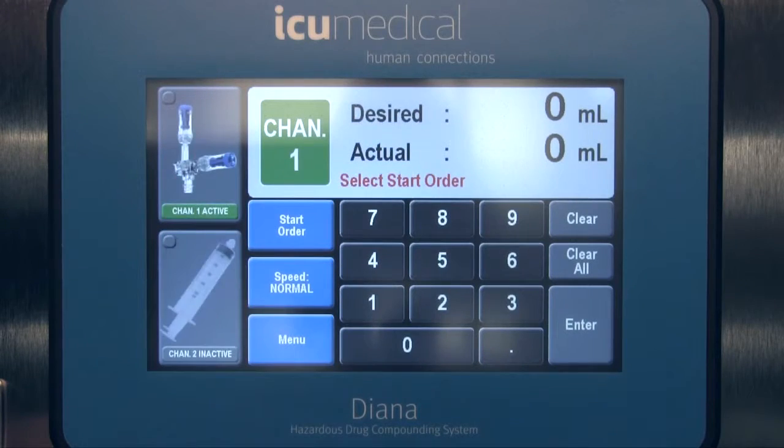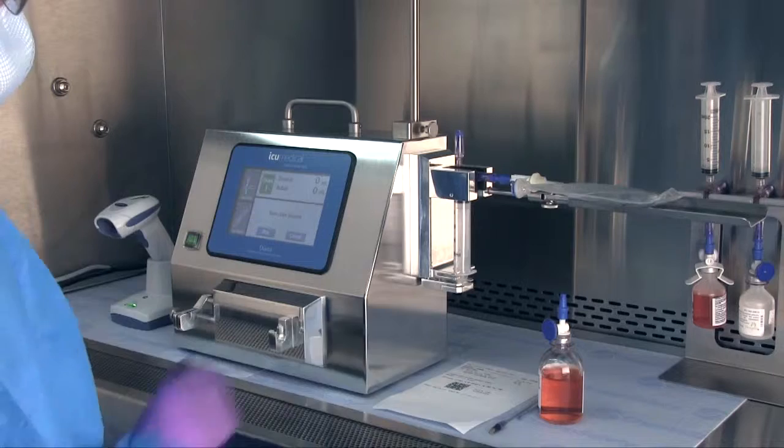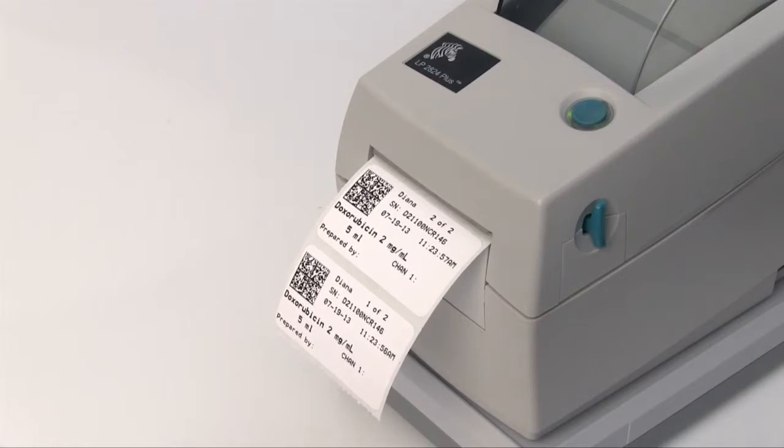Next, select the Channel 1 icon in the upper left of the touchscreen display, then touch Start Order to begin the compounding process. A prompt will come up on the screen directing you to scan the patient order. Scan the barcode that appears on the patient order and Diana will save the order number associated with the code for output to a label when the mix is complete.